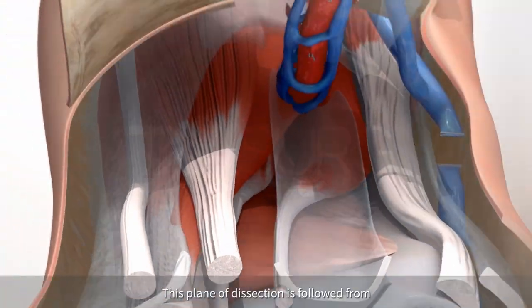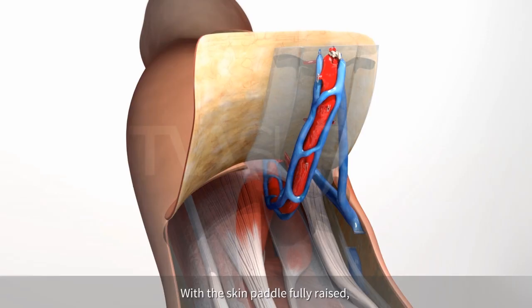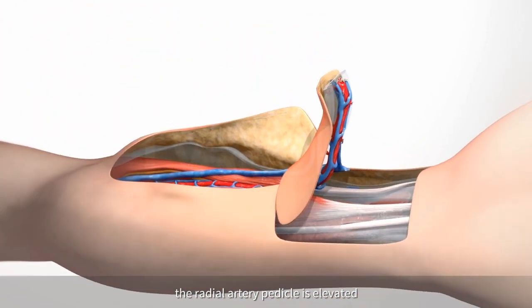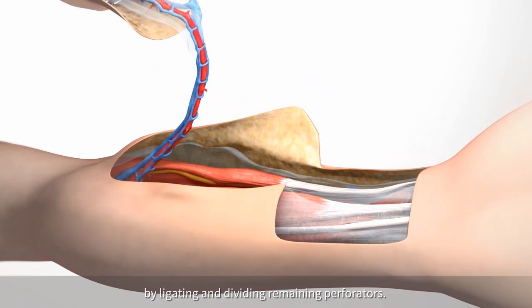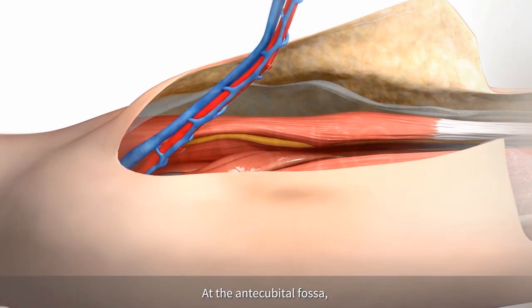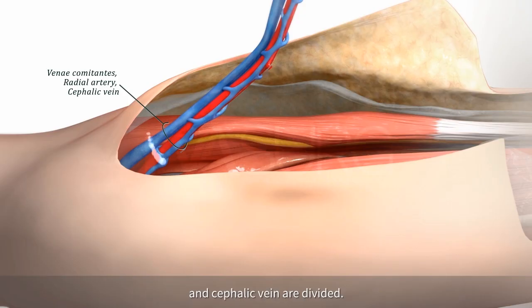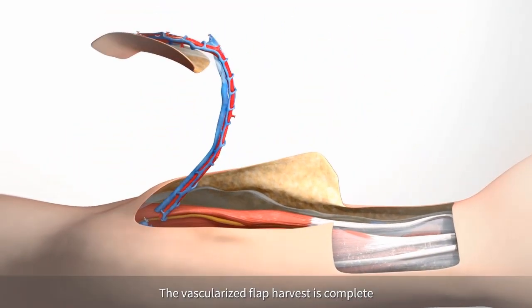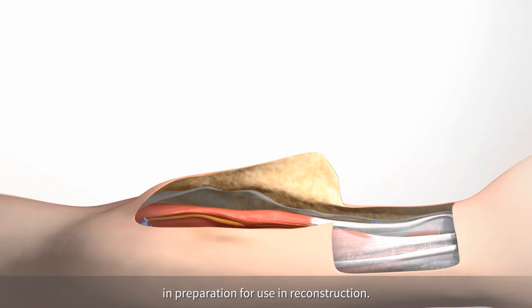This plane of dissection is followed from the distal border of the skin paddle to the proximal border. With the skin paddle fully raised, the radial artery pedicle is elevated from the intermuscular septum by ligating and dividing remaining perforators. At the antecubital fossa, the venae comitantes, radial artery, and cephalic vein are divided. The vascularized flap harvest is complete and is removed from the surgical field in preparation for use in reconstruction.